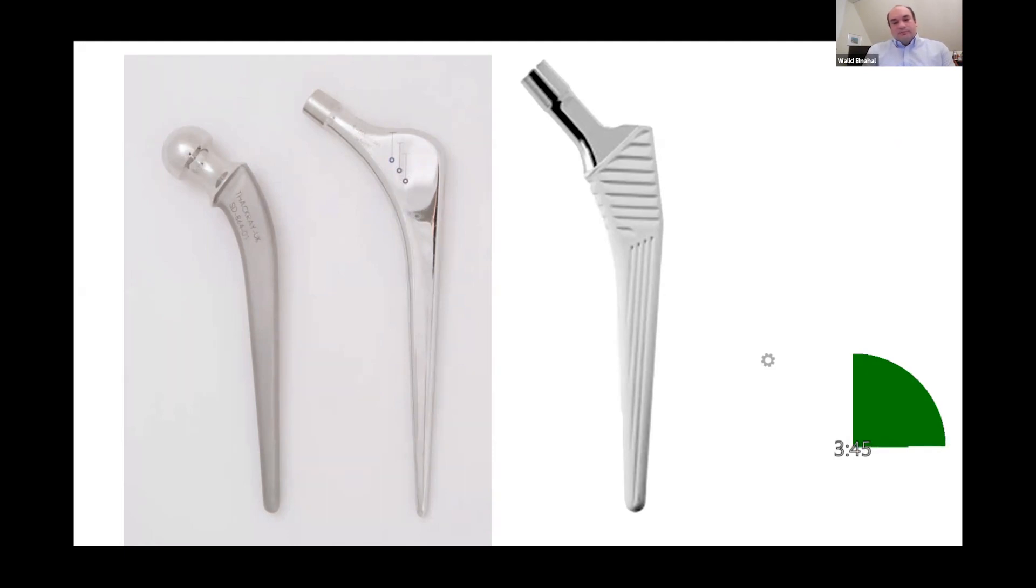The trapezoidal metaphyseal component allows metaphyseal fixation, and it has a tapered stem for fixation to the metaphyseal diaphyseal portion of the femur. What is the white color of the surface? This is the hydroxyapatite coating. So with the Corail stem, it's fully hydroxyapatite coated. It acts as an osteoconductive material to allow bone ongrowth on the stem.